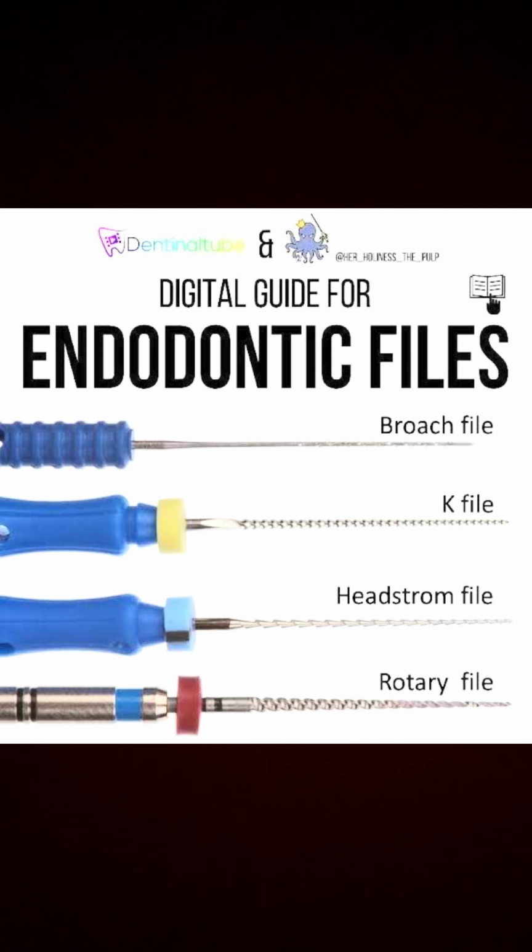K-type endodontic instruments are used to improve the efficiency of root canal preparation. Originally manufactured from round tapered piano wire, the stainless steel wire is ground along its long axis into a four-sided square cross-sectional or three-sided triangle cross-sectional tapered shaft that is twisted into flutes extending 16 mm from the top to the tip of the cutting blade.